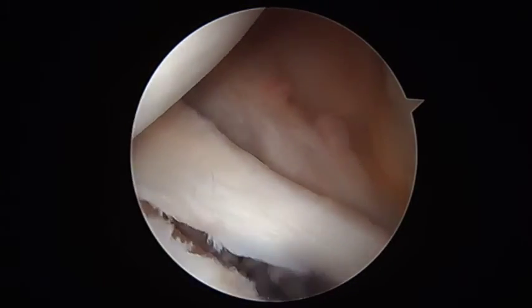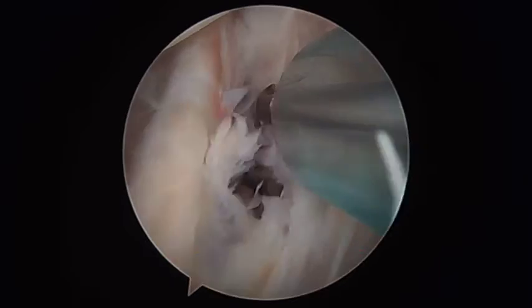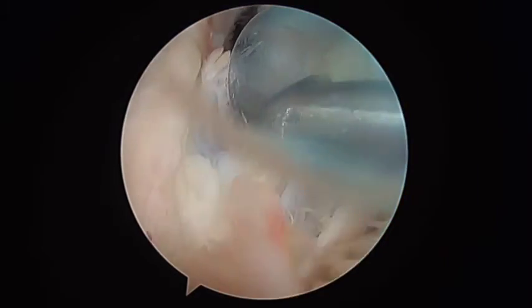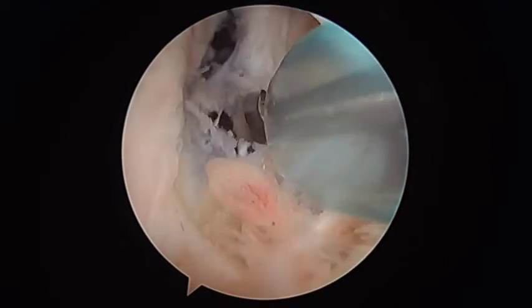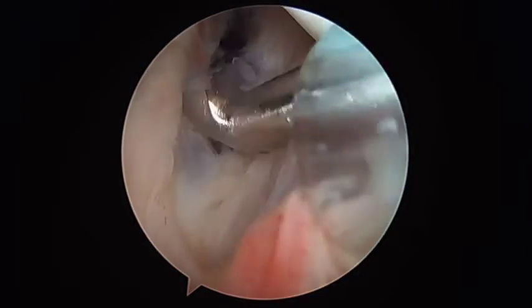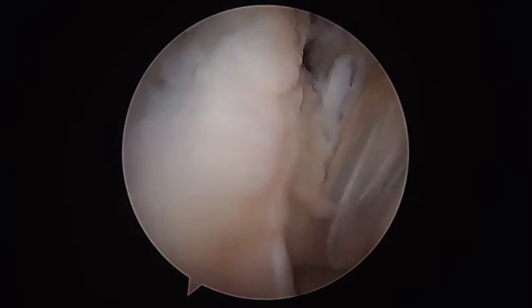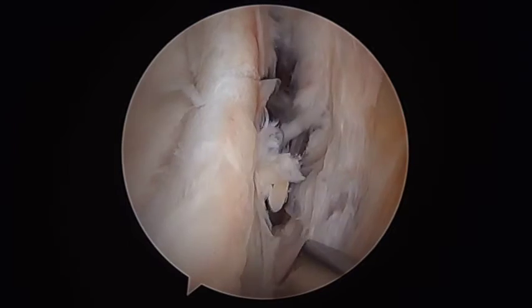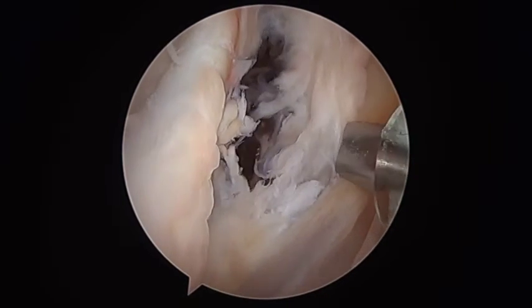A standard posterior viewing portal was established, followed by the establishment of an anterior-inferior rotator interval portal via an outside-in spinal needle technique. Diagnostic arthroscopy was notable for intact cartilage surface of the glenohumeral head. The labrum was inspected. There was a Bankart tear noted from the 6 o'clock to 12 o'clock position.